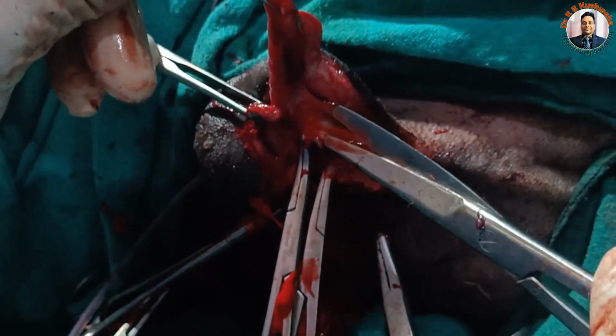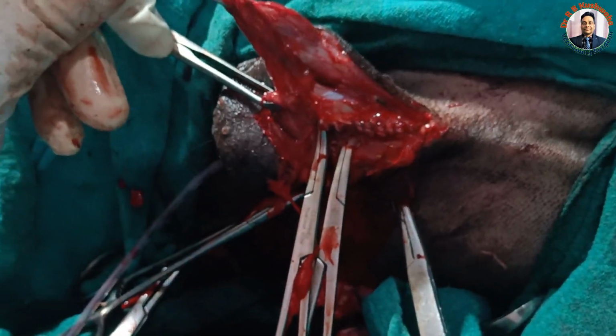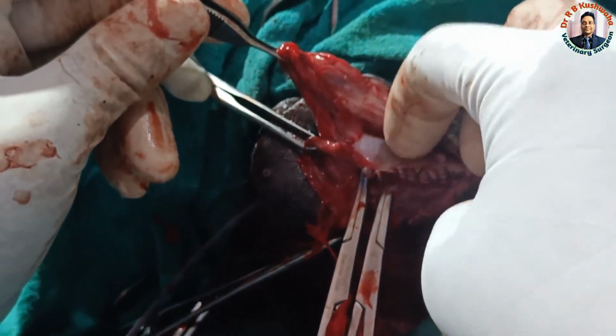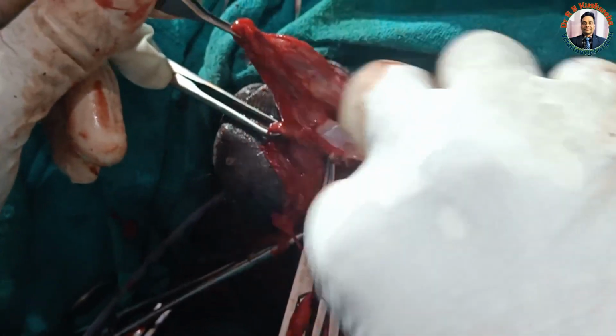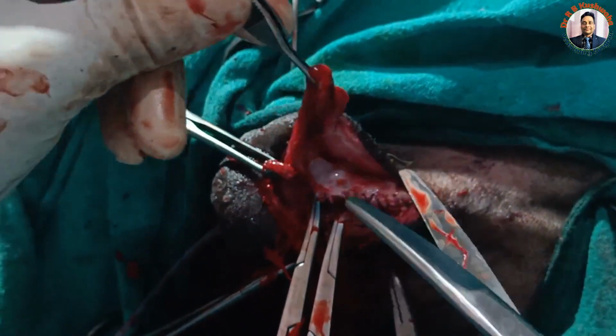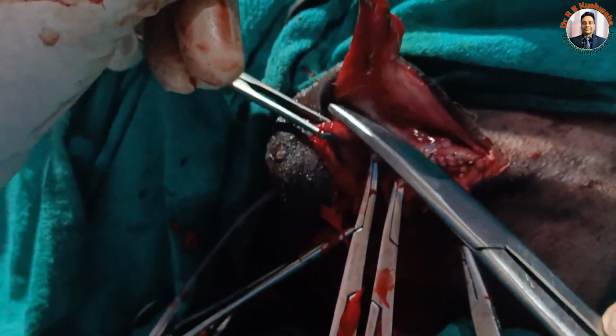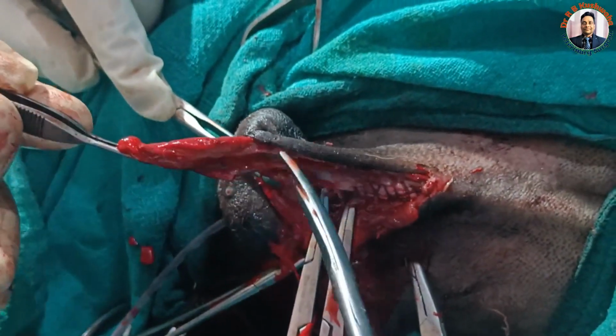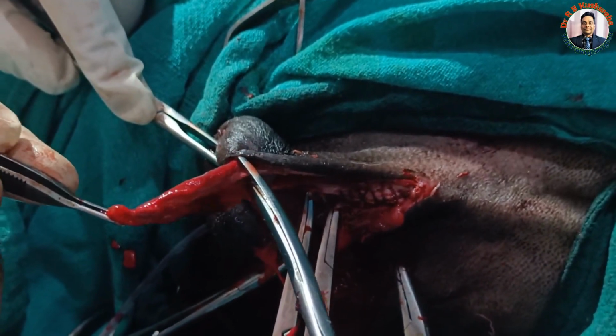Because there is no point in keeping this much urethra. So now you put this normal canal area. So here definitely, if you know the normal anatomy of any structure, that will definitely help you in doing surgery.